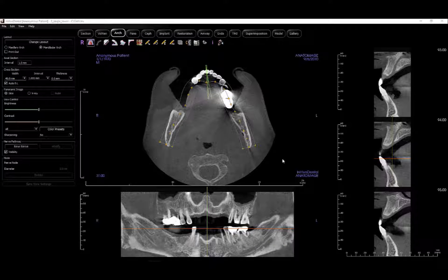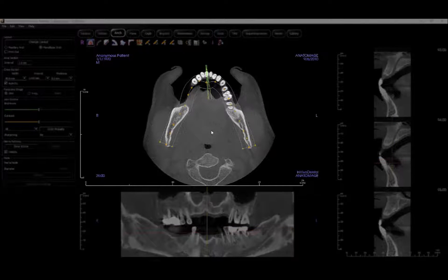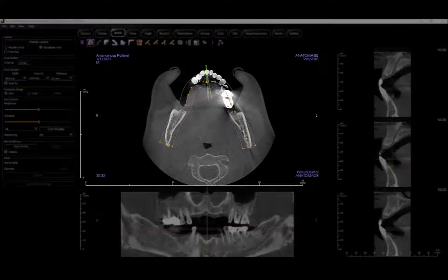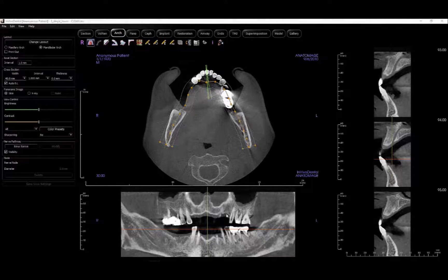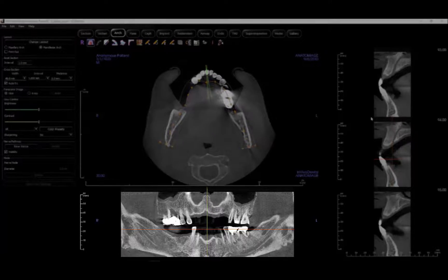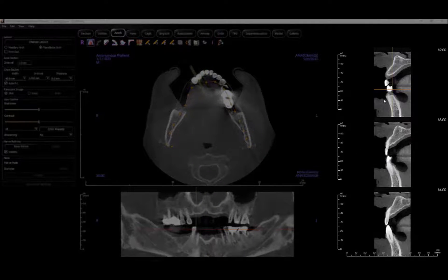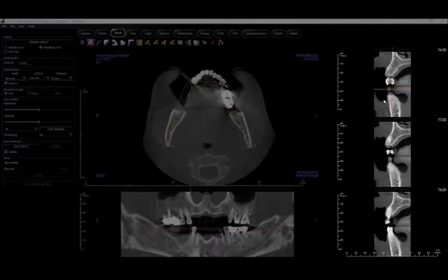The purpose of the arch section tab is to create a panoramic image for tracing the inferior alveolar nerve canal in mandibular implant cases. It can also generate cross sections for making precise measurements along the arch. The rendering windows in this tab display a large axial view as well as a pano view below and cross sections on the right that correspond to the green lines in the arch spline.